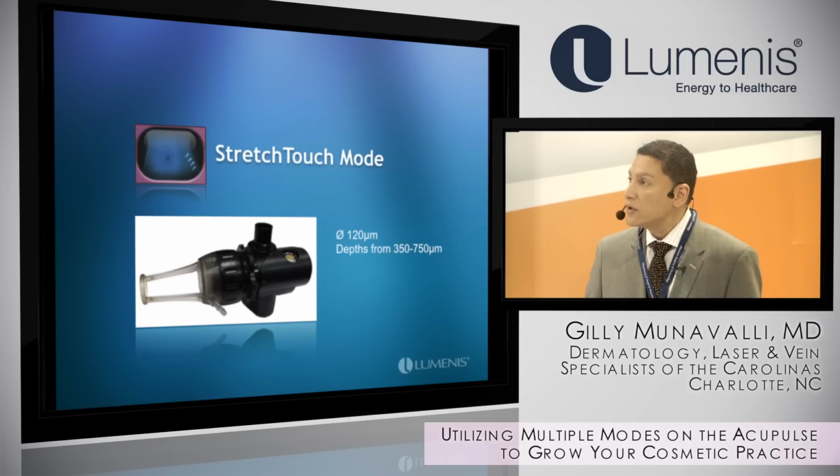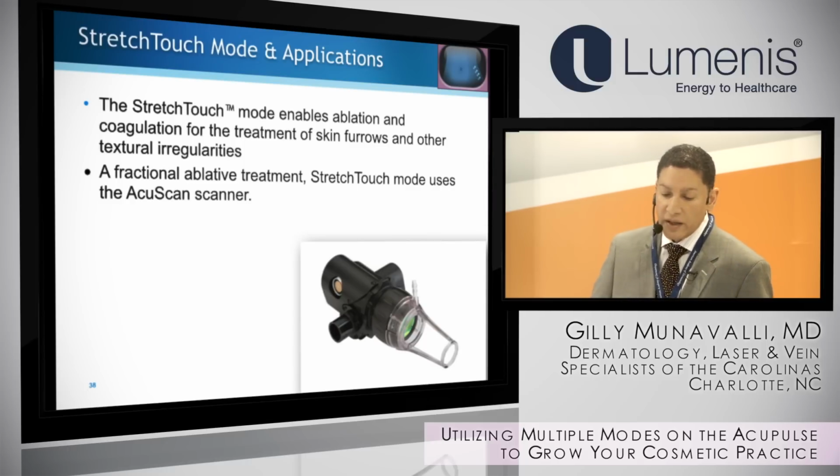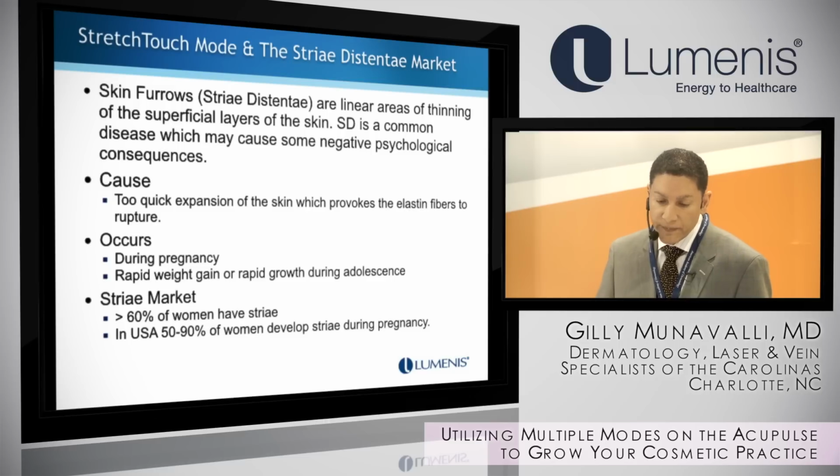So Stretch Touch, we have some experience with this. It uses the AcuScan handpiece again, and we're basically targeting the stretch marks only. Our goal is to try to increase dermal collagen and elastic tissue and improve the appearance of stretch marks. Why do they happen? Many different reasons.